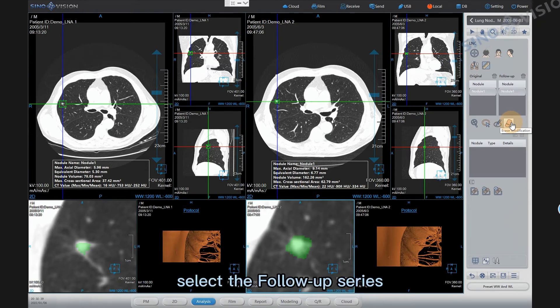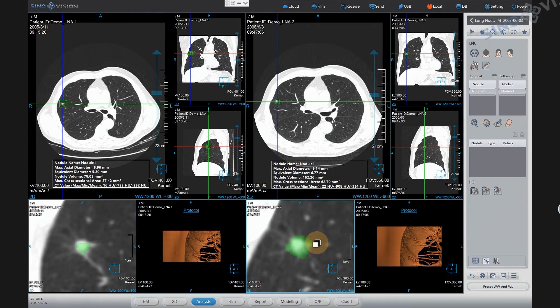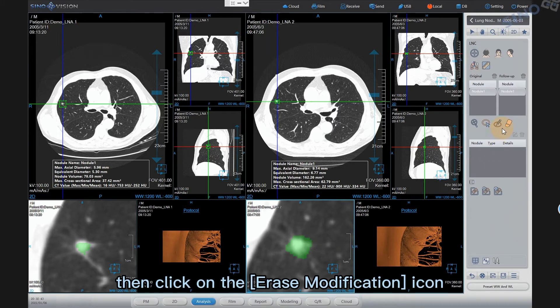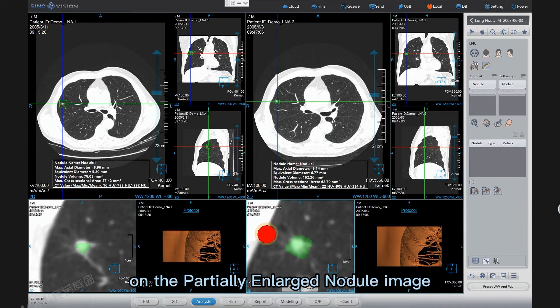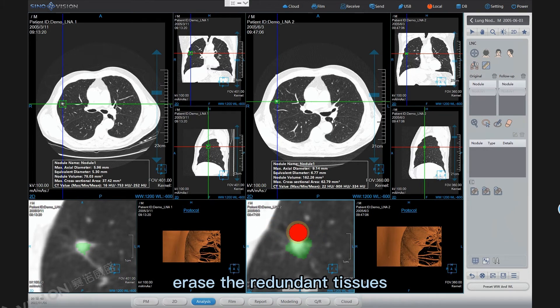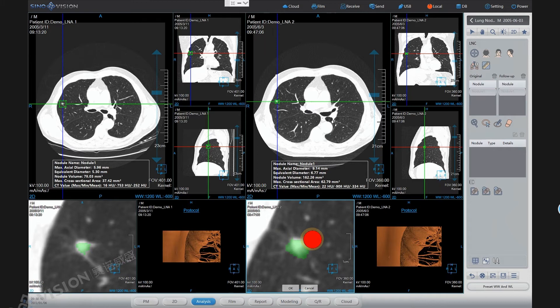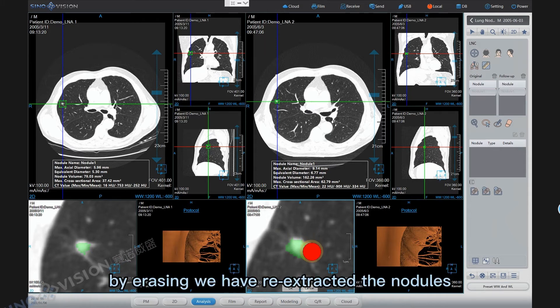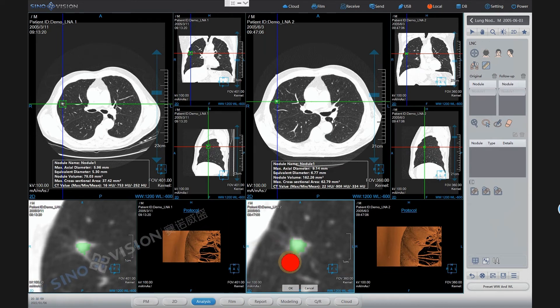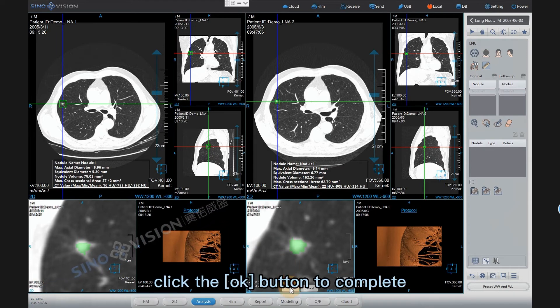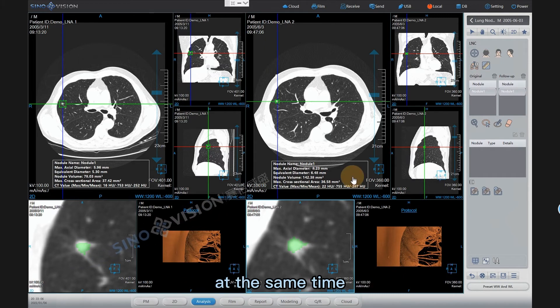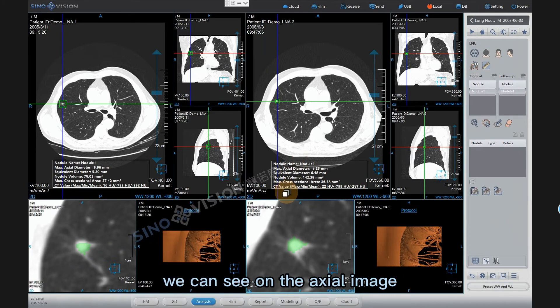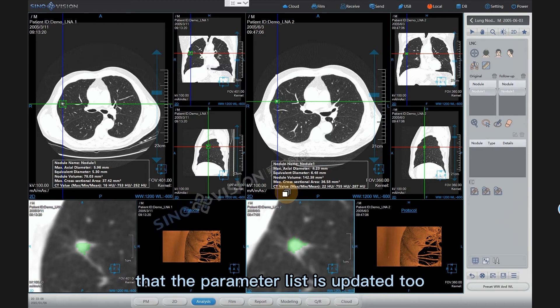Erase modification: Select the follow-up series, then click the Erase modification icon. On the partially enlarged nodule image, erase the redundant tissues. By erasing, we have accurately extracted the nodules. After erasing is complete, click the OK button to complete the modification of the extraction. On the axial image, the parameter list is updated too.